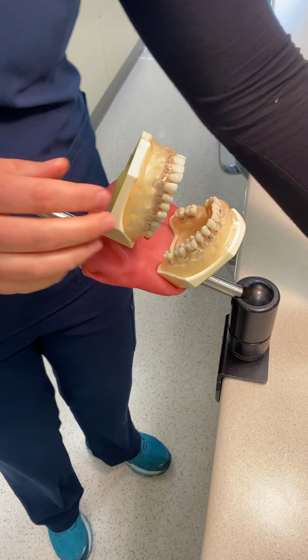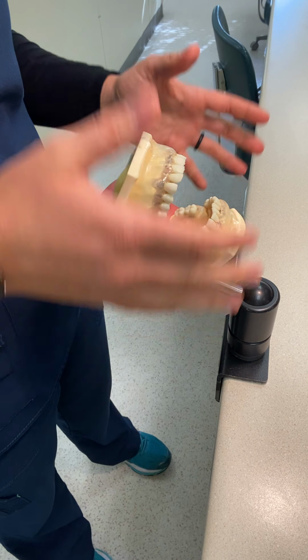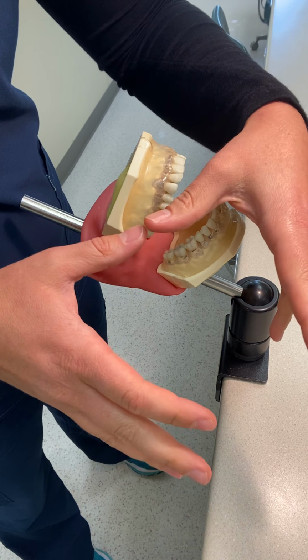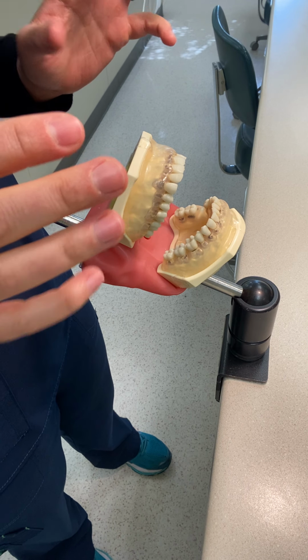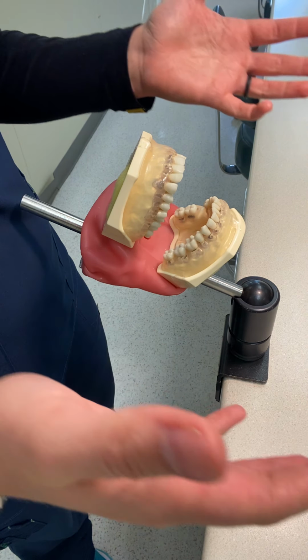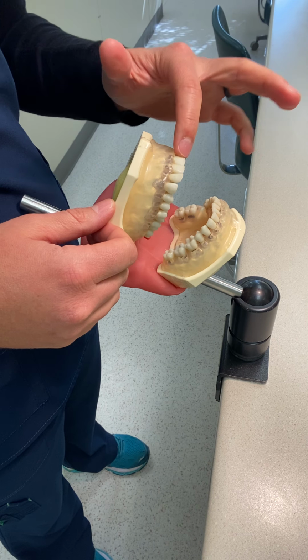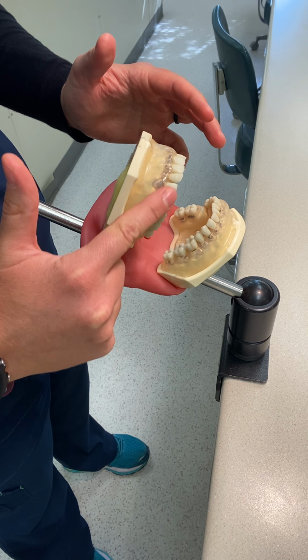So key items: always determine surfaces toward and away for left-handers from 4 to 3 o'clock area, right-handers 8 o'clock, 9 o'clock area. Whenever you treat your surfaces toward, it is also from that same spot down lower on the chair. When you treat surfaces away, you come up to 12. Divide the front teeth in half. For posterior teeth, it's the entire side.